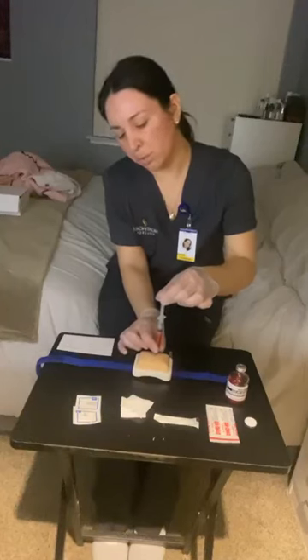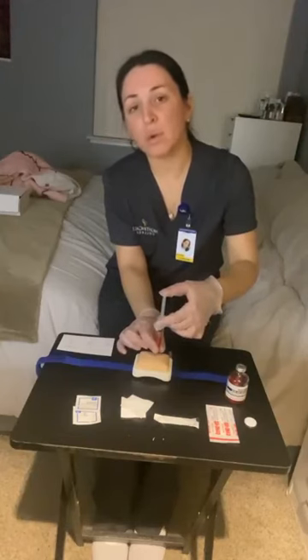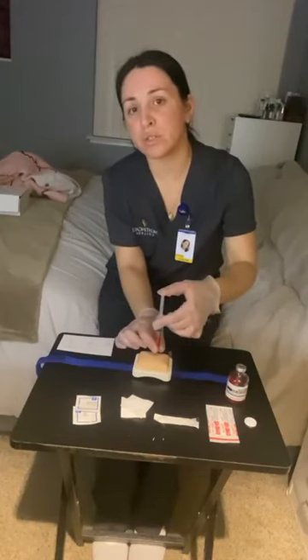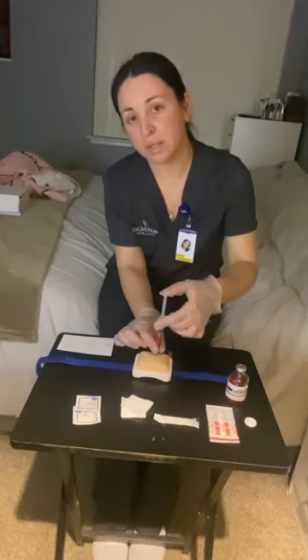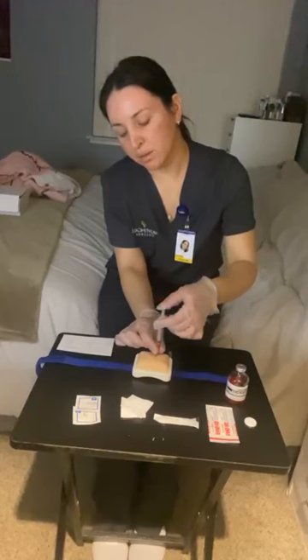If I see no blood, then I will inject, and I'm going to inject at 10 seconds per milliliter. Okay, and I would wait 10 seconds.